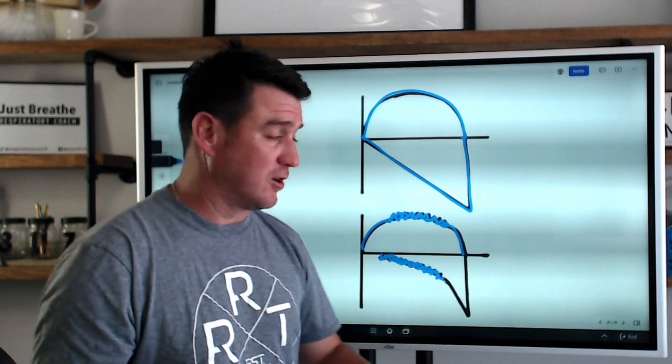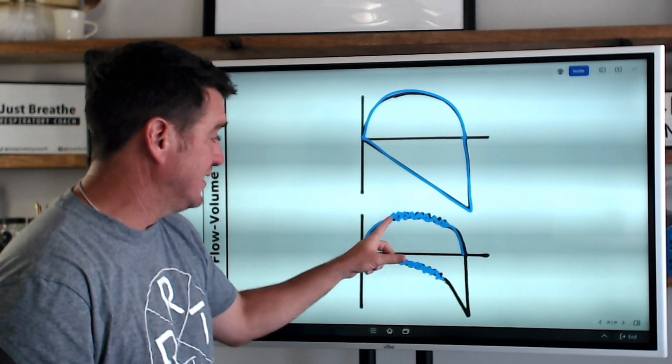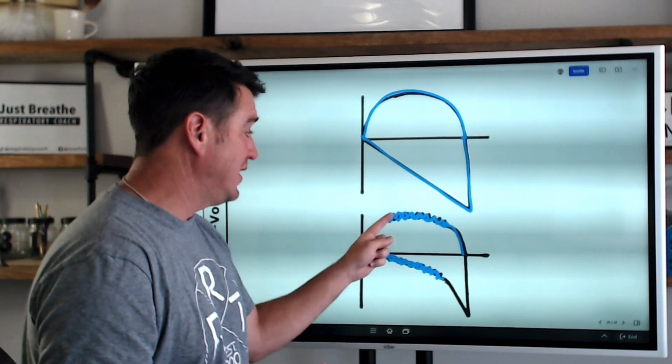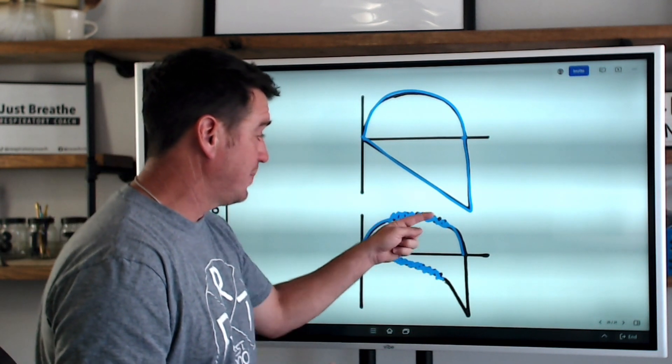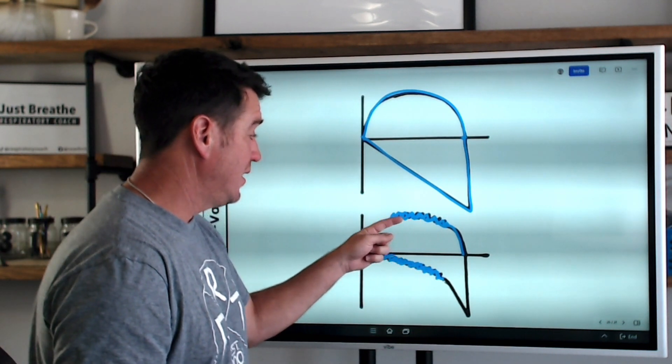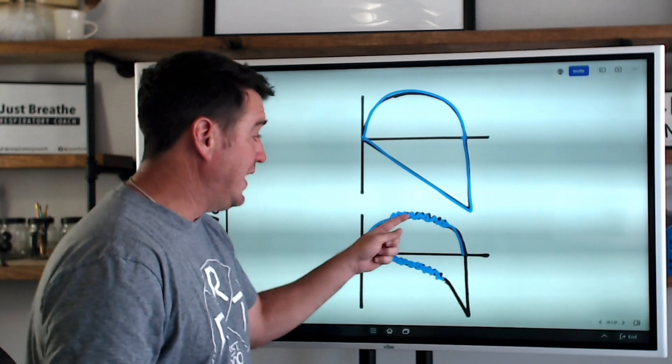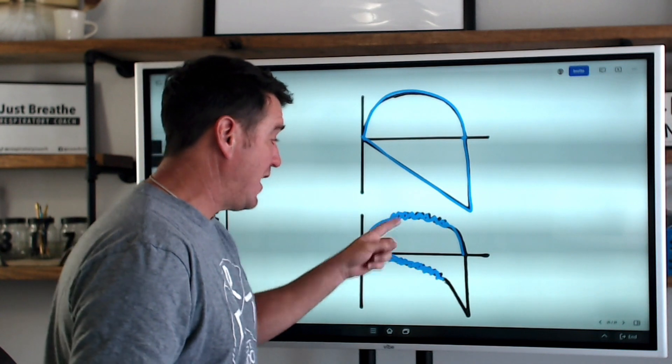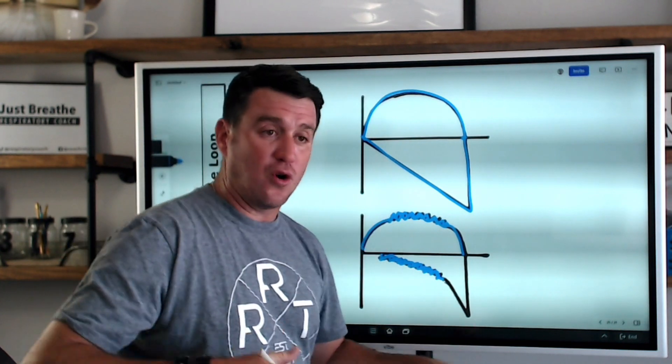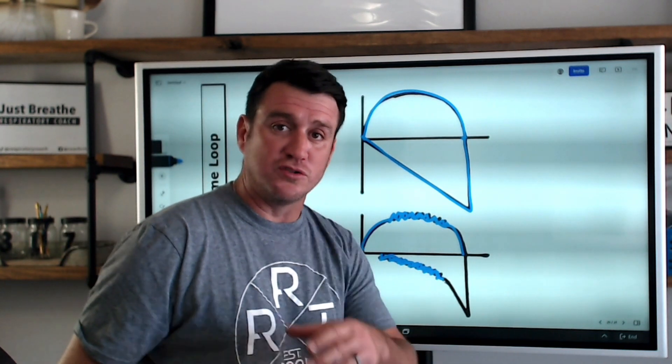So you have three different options when you see a sawtooth pattern: you either need to suction your patient, drain the water out of the circuit, or perhaps administer a bronchodilator.